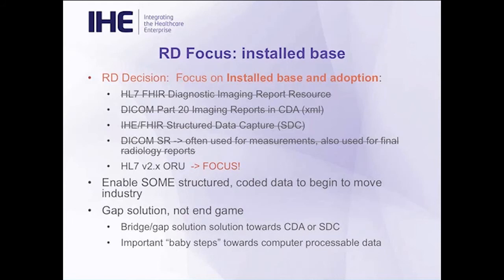So, results distribution. We had to make some decisions on what to do with this profile. Looking at results distribution, there's a lot of different ways that we could go. We could look at many different standards which are available for structured reports or for reports in general. But we decided to specifically focus on the installed base, and we decided to focus on creating as much adoption as possible for this profile.